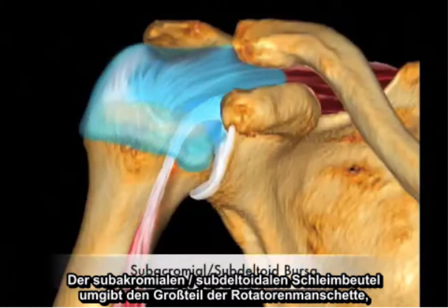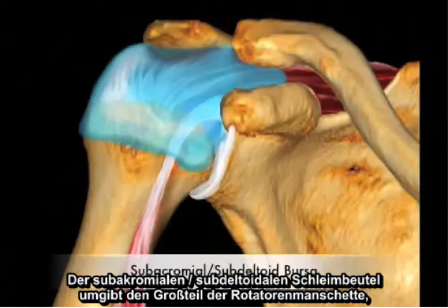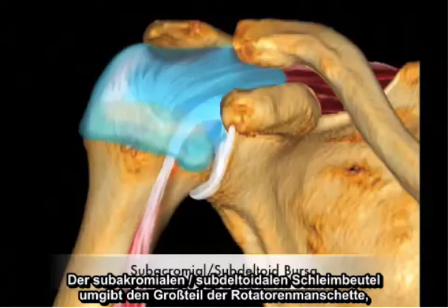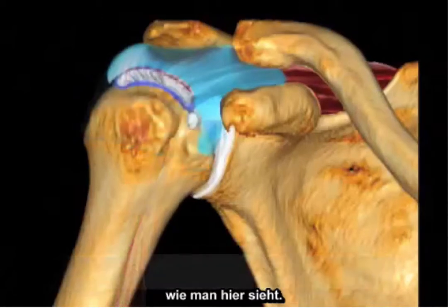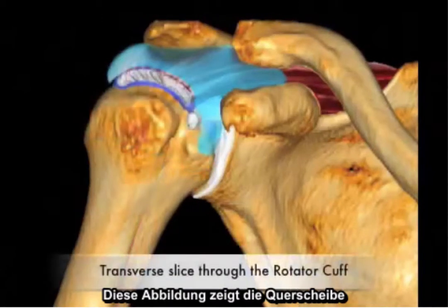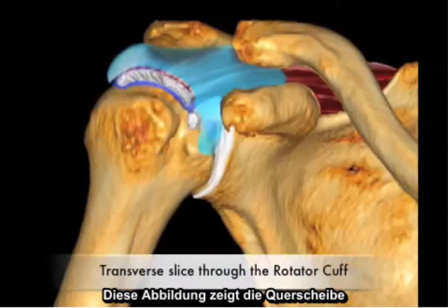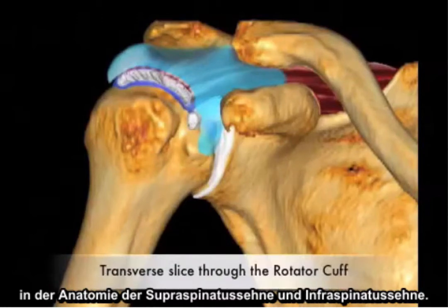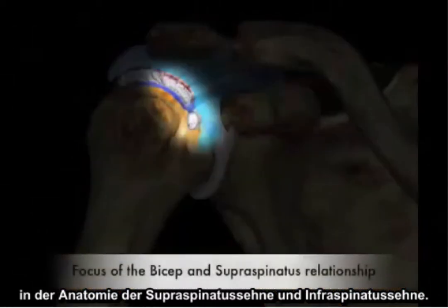Enveloping the bulk of the rotator cuff is the subacromial/subdeltoid bursa as seen here. This illustration represents a transverse slice through the anatomy of the supraspinatus and infraspinatus.